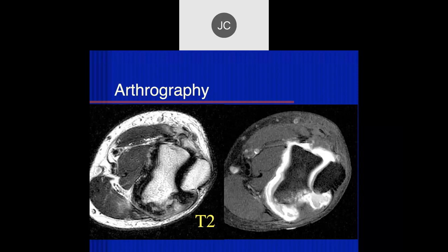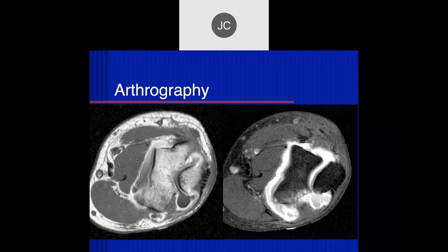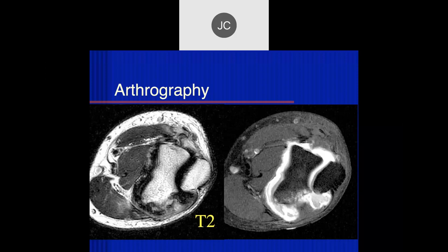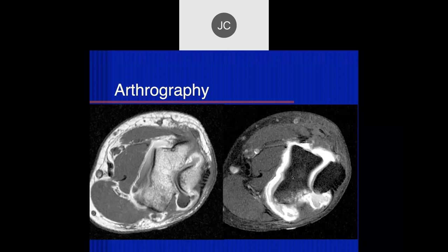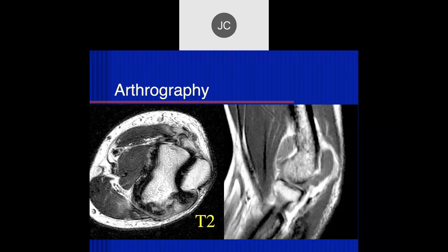I think I see some increased signal at the common flexor origin right over here. On the arthrography, you should have bright signal if you put in contrast. On the T1-weighted image we're getting bright signal, but on T2 it's very dark - so why are we not getting the expected contrast from the injection? It's too concentrated - this is a 1-to-1 dilution instead of the recommended 1-to-200 dilution.